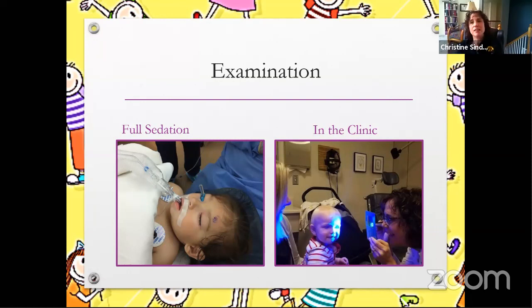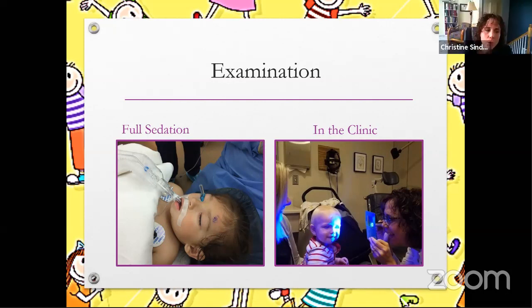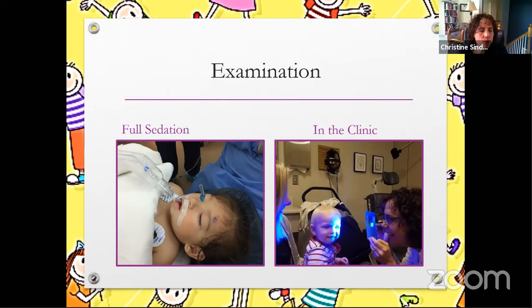If you're going to release the symblepharon, you better put some type of symblepharon ring or a really large scleral lens in place so that the symblepharon doesn't reform. Typically, when you release the symblepharon, you're going to incite some type of inflammation, and it's just going to stick right back together. I'm talking within hours or a couple of days, it'll stick back together. So if you're going to release the symblepharon, you better have a plan to manage that afterward: either amniotic membrane, put a scleral lens in, a symblepharon ring, something like that.